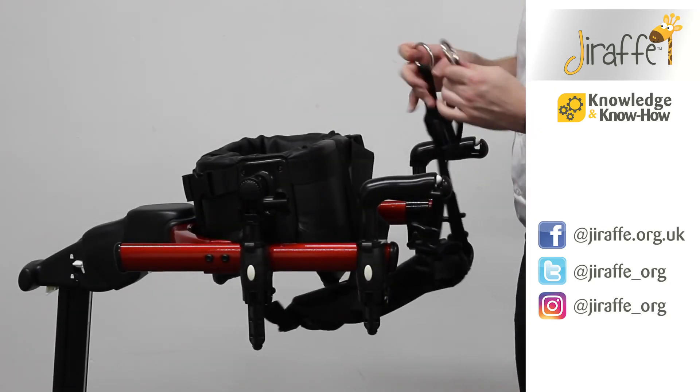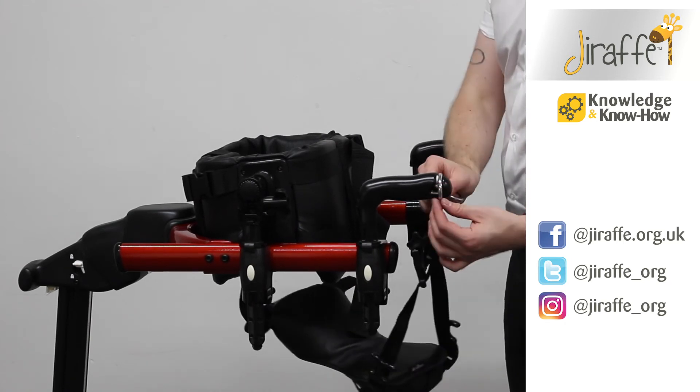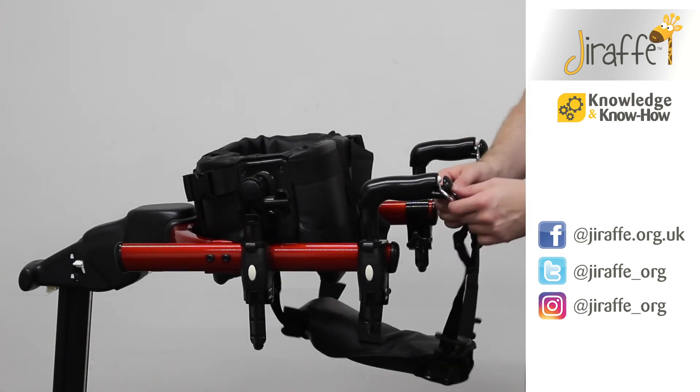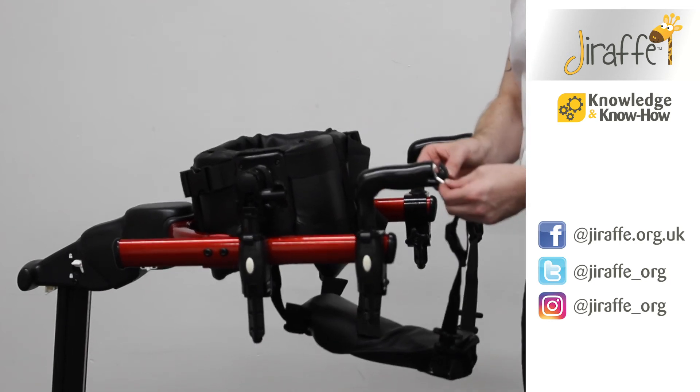The two posterior straps can fit to the handholds. We simply line the hoops up so they're nice and vertical and then push them through the handholds. When you're removing them, you need to ensure that they're at a vertical position to be lifted up.